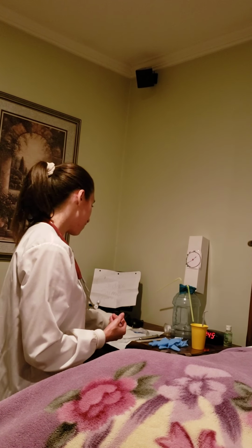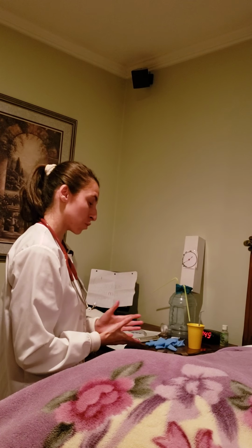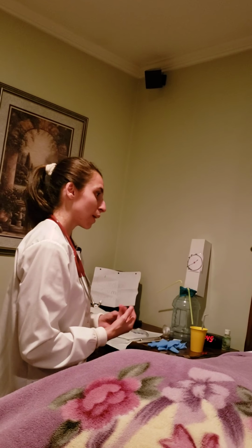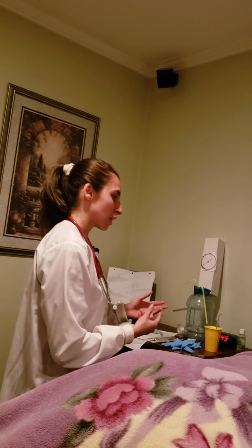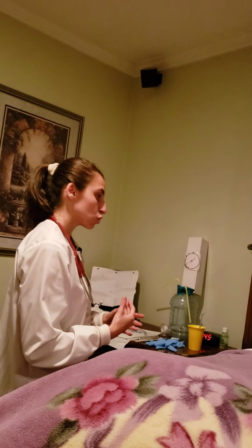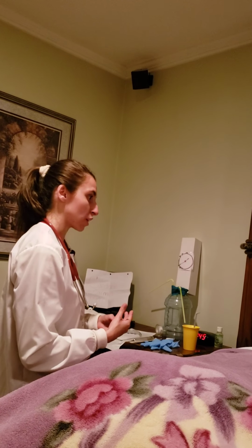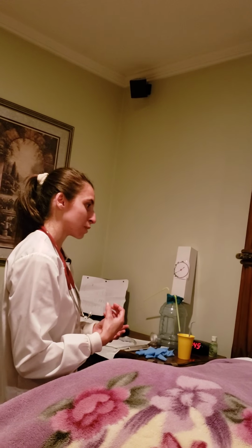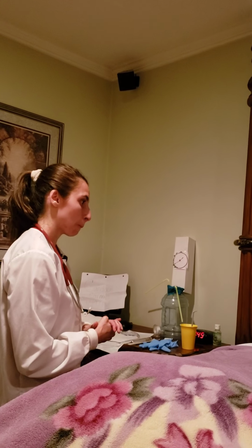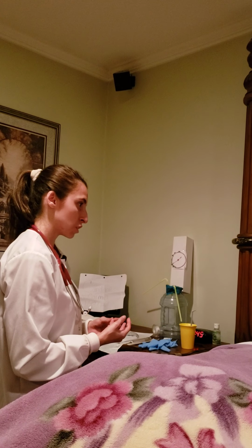Well, the end of the tube is blue, also known as a pigtail, because it is known as an anti-reflux valve. And basically what that means is, as the NG tube is removing those secretions into that suction tube, it's going to let air in. So it's going to help prevent reflux. So the gastric contents are removed in a different way than it's originally supposed to. What are some complications that can occur with this procedure?